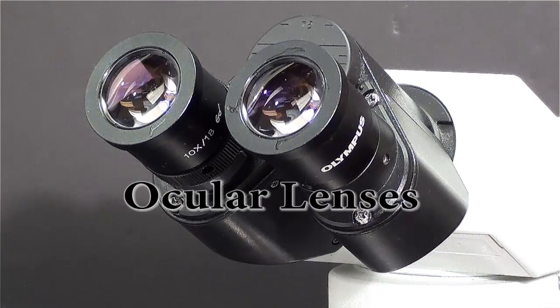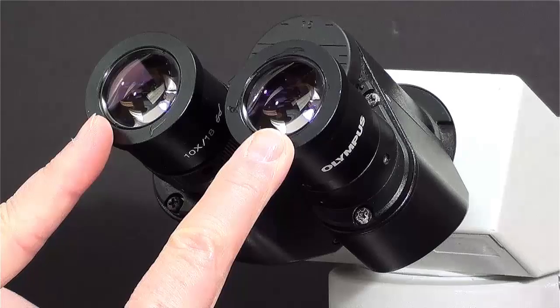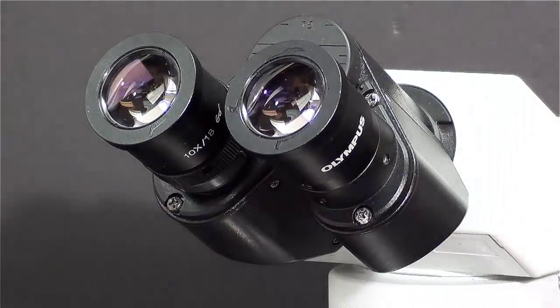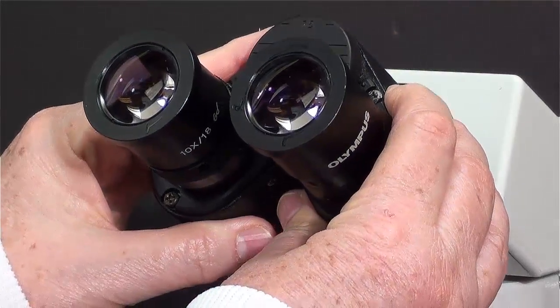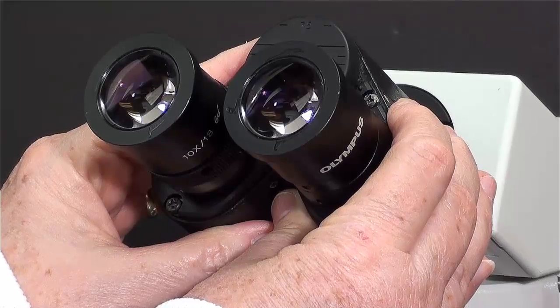In order to properly use a binocular microscope, both eyes should be seeing the object at the same time. The microscope is built so that you can adjust the placement of the ocular lenses to fit your interpupillary distance, the distance between your two eyes.